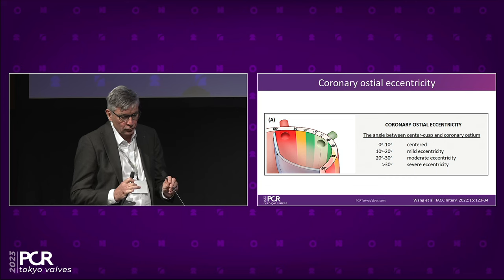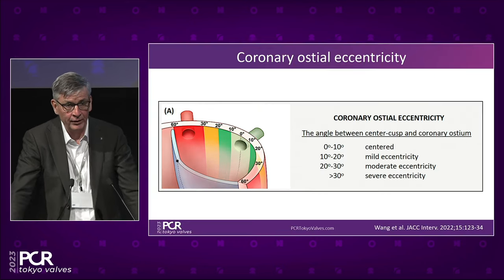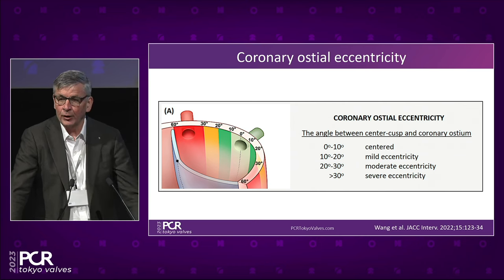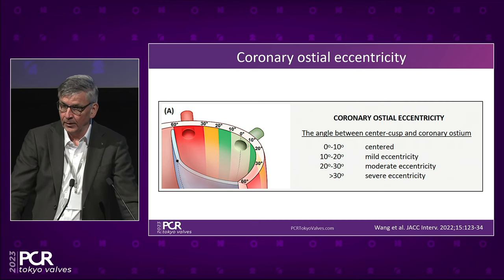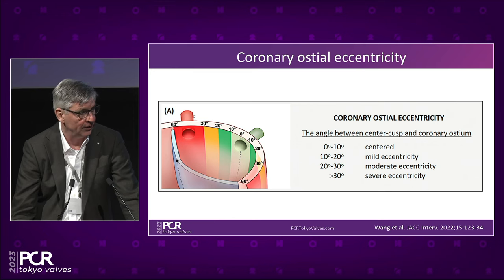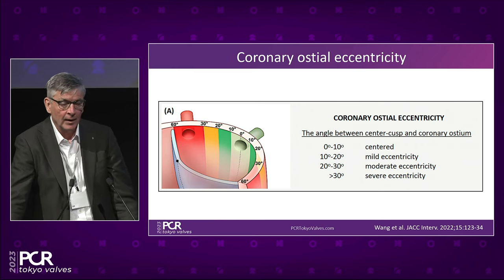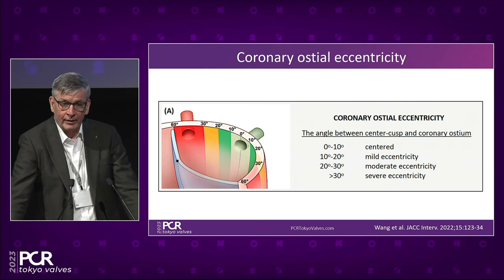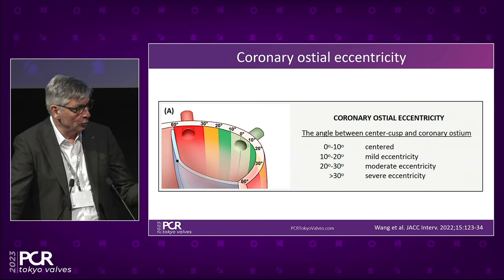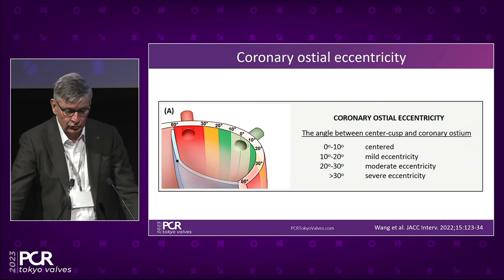I'm just going to finish off here showing something which maybe not everyone is aware of, but if you ask a cardiac surgeon, he or she is fully aware, that sometimes the coronary artery is not taking off in the middle of the cusp, particularly from the right. You expect it to be in the middle of the cusp, but sometimes you have what we call coronary ostial eccentricity, so the takeoff will be closer to the non-coronary cusp. In patients with tricuspid aortic valves, it's about 3% who have coronary ostial eccentricity. In patients who have a bicuspid aortic valve, it's around 7%. And that, of course, will also make it more difficult to access the coronary arteries after TAVI.